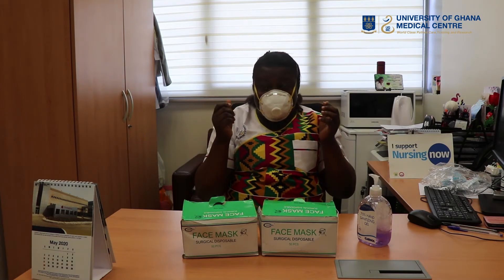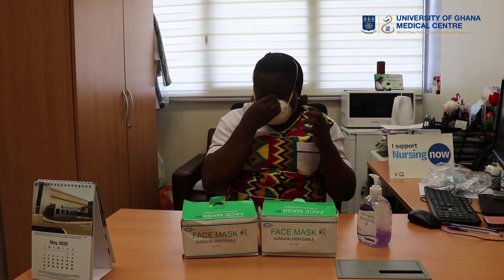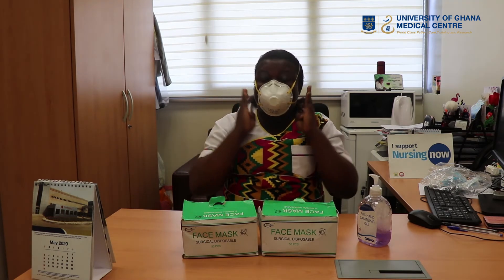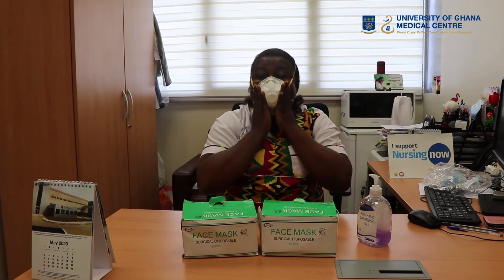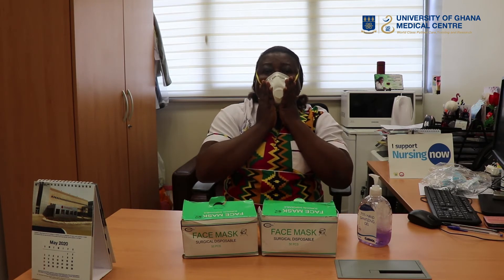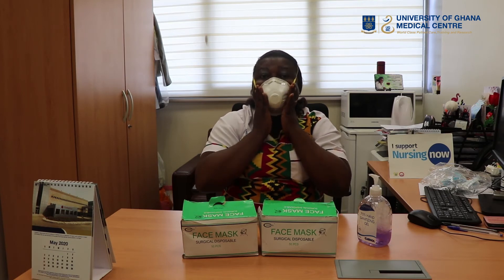When you finish, you have to check whether there are leakages. But before that, press the ring to fit the bridge of the nose. In checking for leakages, you use your four fingers to touch the two sides and press. Then you breathe in — when you breathe in, the pointed part will draw back. When you breathe out, it brings it out. This tells you that there are no leakages. That's how you wear the N95 or the respirator.